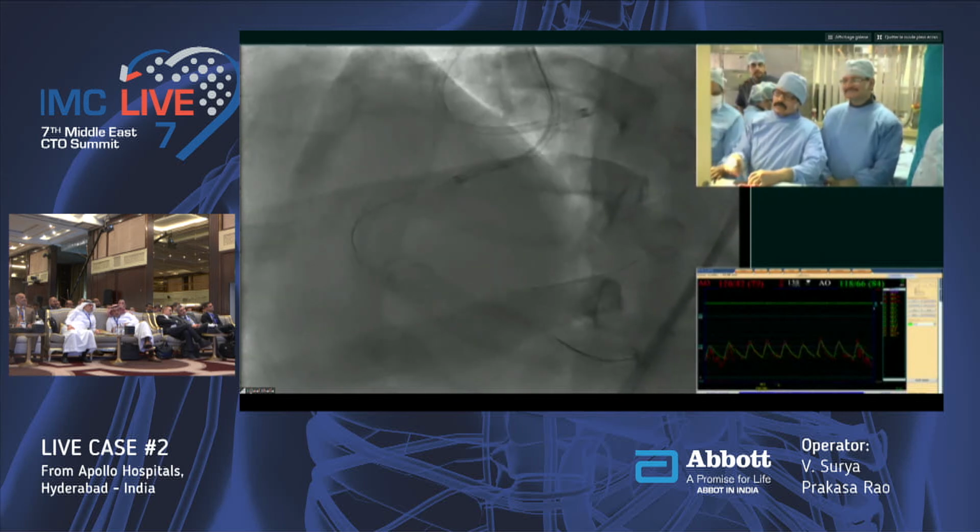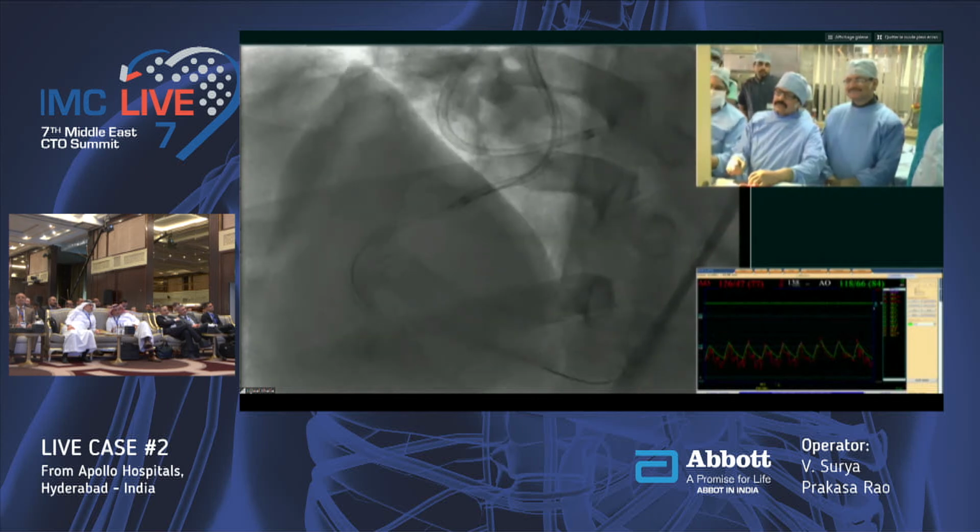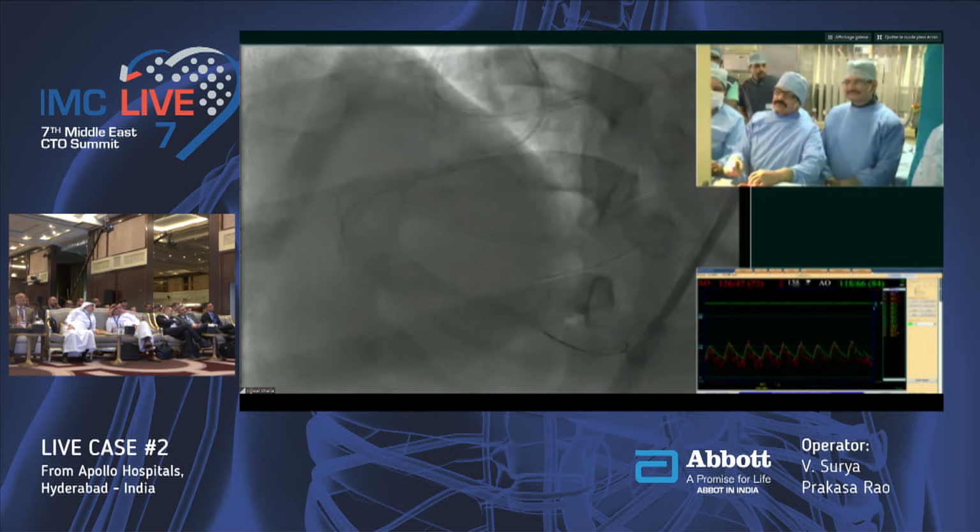ACT is 319. We're monitoring every half hour.